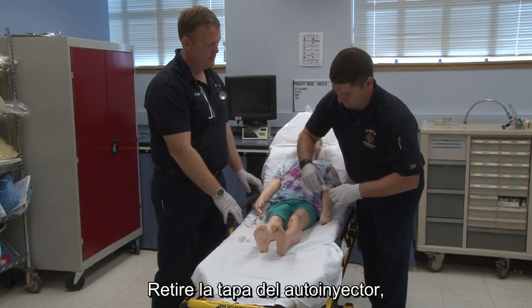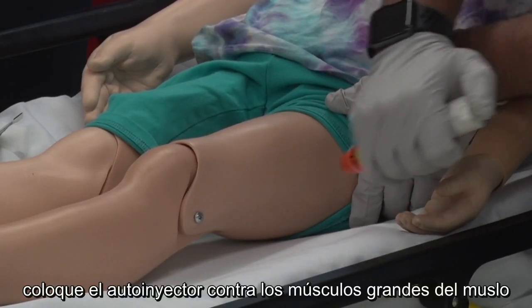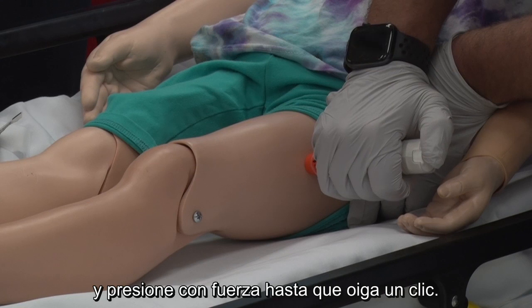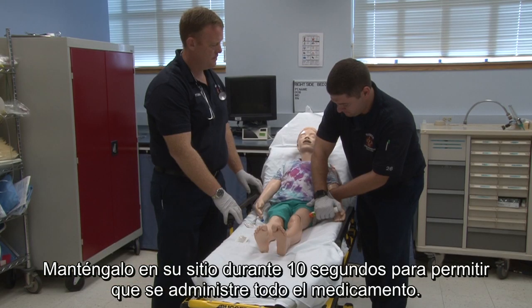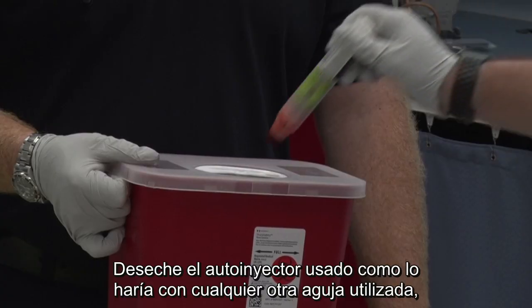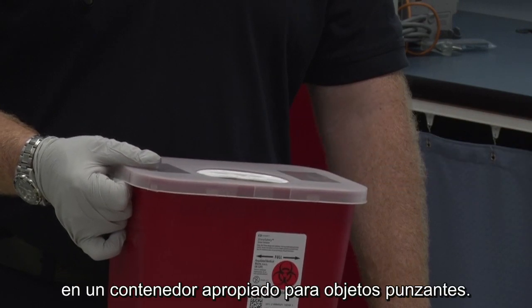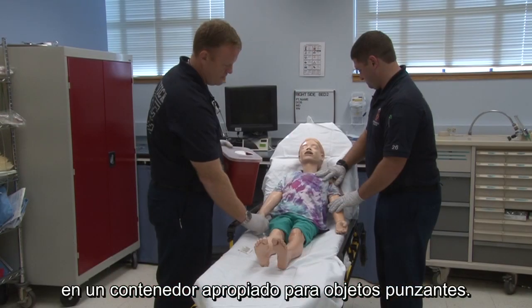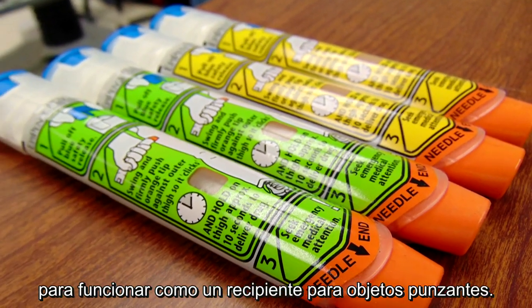Remove the cap cover from the auto-injector. Place the auto-injector against the large muscles of the thigh and press hard until you hear a click. Hold it in place for 10 seconds to allow all the medication to be delivered. Dispose of the used auto-injector in an appropriate sharps container. The container the device was removed from may be designed to function as a sharps receptacle.